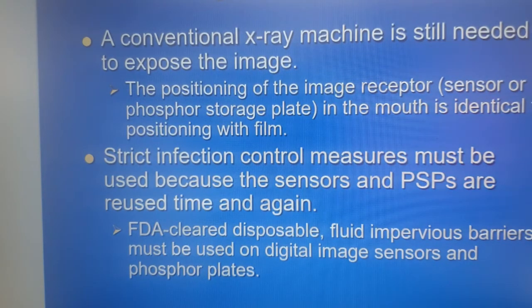With our direct image, we essentially take an X-ray, and the sensor has a silicone chip that is sensitive. It makes use of a CCD that essentially converts X-rays to electrons. Electrons are then stored as pixels, and upon exposure, electron charges are then converted to form a digital image. So that's what happens with direct imaging.